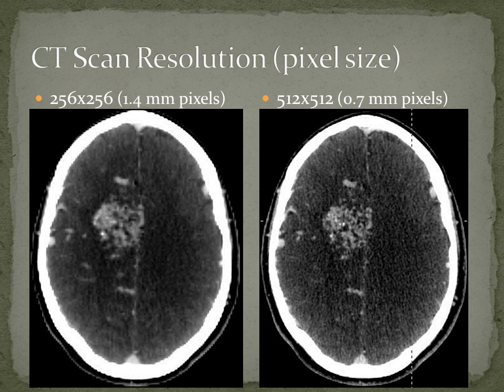The image on the left appears to be a smoother, nicer image. It's less noisy, and that's because you have spatial averaging and things tend to look good. The same thing happens very often in CT and MR scanning when they do 3 or 4 millimeter slice thicknesses. The images look better because you have a better signal-to-noise ratio, but your spatial resolution is worse. So you've got to be careful about that.